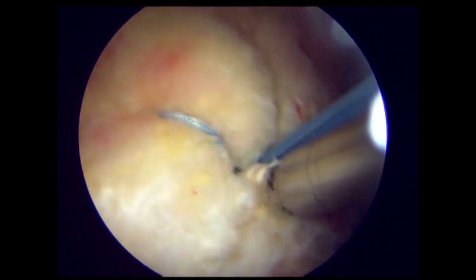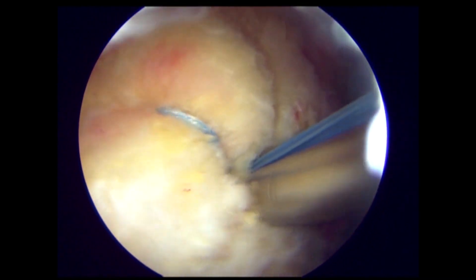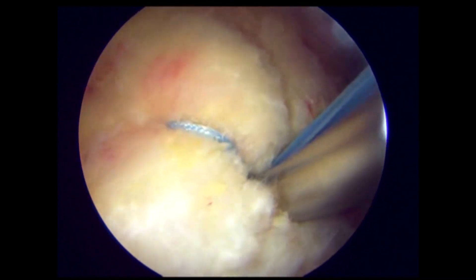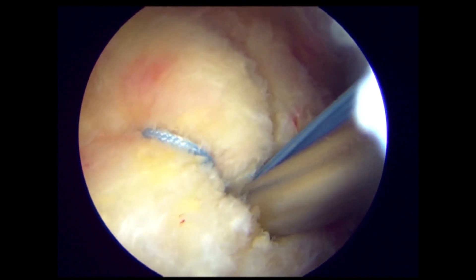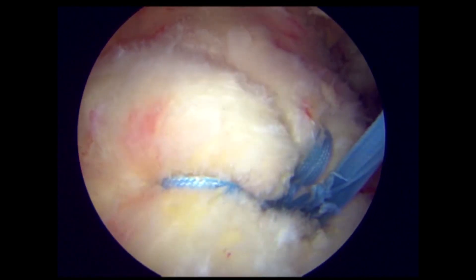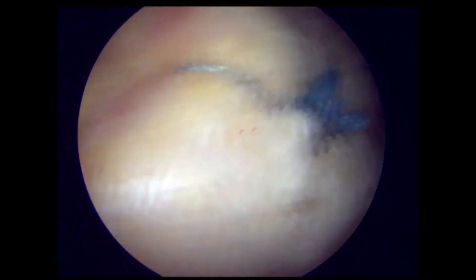The eyelet on the end of the anchor allows for up to six mini tape tails to be passed and fixated to bone. Using this anchor, a surgeon may have the freedom to use a multitude of suture configurations needed to fix all rotator cuff tear types.